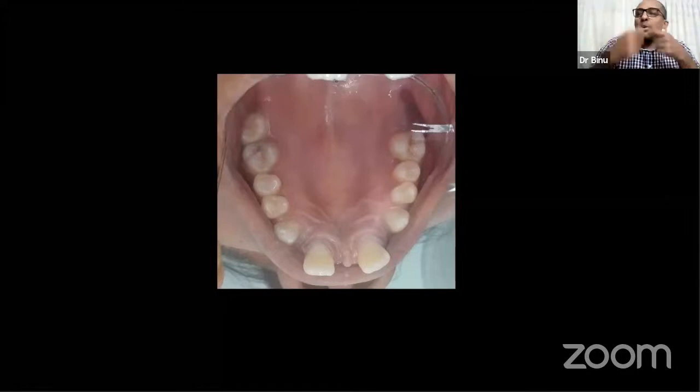You take a picture, just throw it onto the granite table and all that. Just let the staff take it, pouch it, autoclave it, put it nicely. Nothing's going to happen. Even if it scratches, just buy a new one. It's under 200 rupees I'm talking about. So it's attitude. Searching on Amazon, you can get all these mirrors, which are very cheap, 200, 300 rupees. That's it.